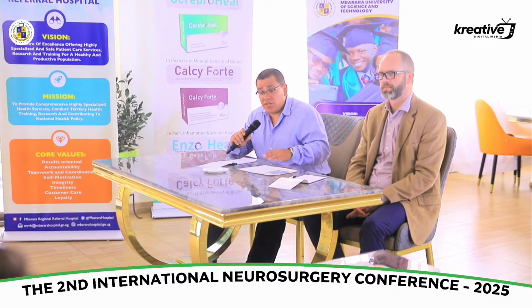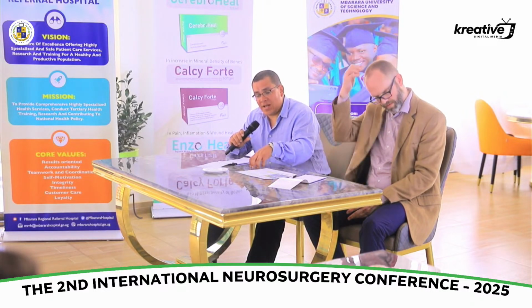And as far as the ICP goes, there is a parameter in the transcranial Dopplers that is a pulsatility index, and another one that's also called the resistivity index, that basically tells you how much resistance to blood flow you're encountering in the patient's brain. The more resistance that you encounter, there is pressure that is fighting against that. So it's not going to tell you the ICP is 20 or the ICP is 5. But in the right, proper clinical setting, let's say somebody with a TBI with a low GCS, if those parameters are high, the pulsatility index for example, then you have a high suspicion that that patient has increased ICP, and you should treat it as such.